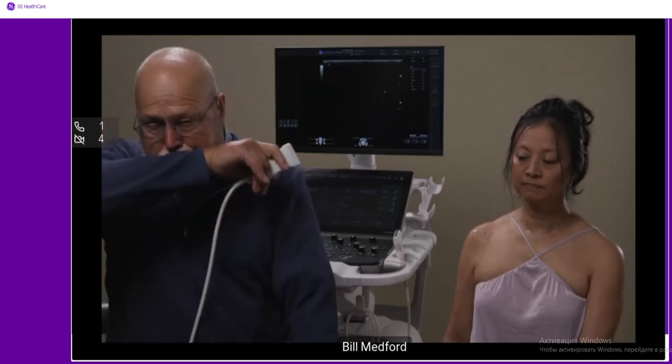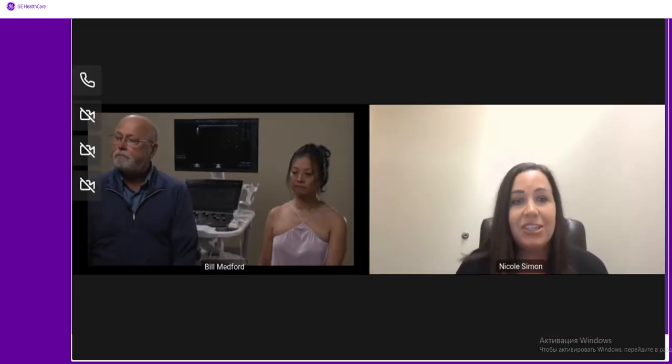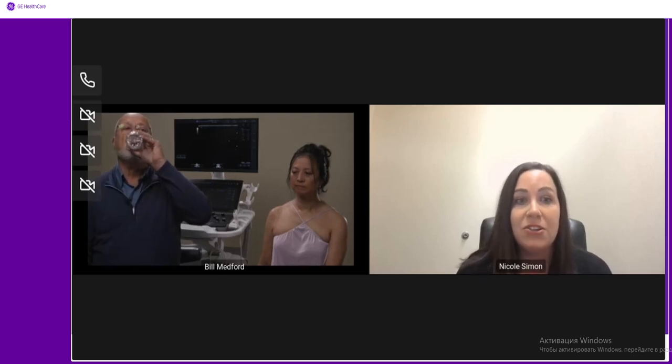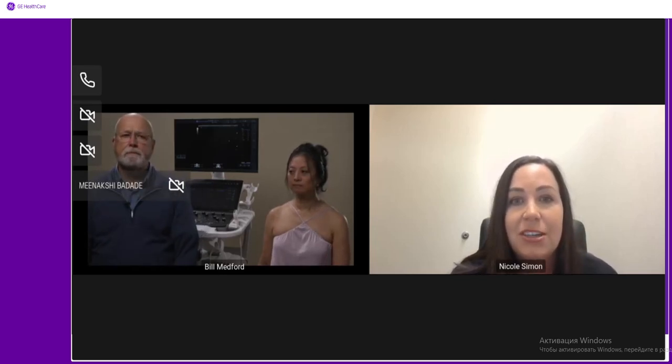Thank you both. We'll take one more question. The question is how to differentiate easily between deep and superficial muscles, particularly in emergency cases. Dr. Meenakshi, can you help us with this question?